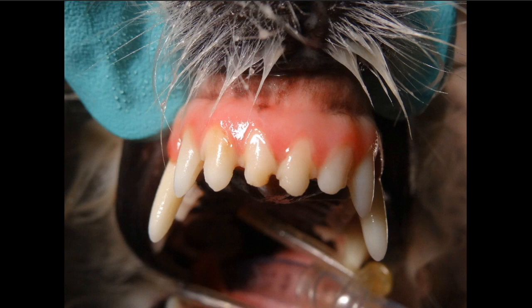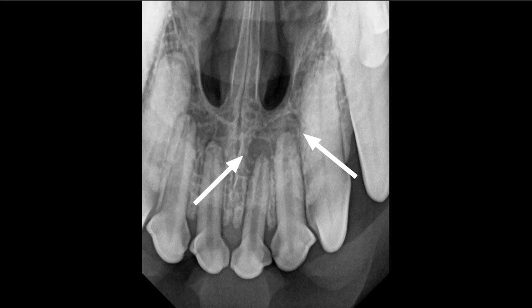And if you look closely there, you're going to see that there's some discoloration. Look at these three teeth versus the color of the other teeth, especially that second left maxillary incisor that's to the right of the arrow there. That one's pretty white. Those are kind of cream colored. So that's a good indication there might be some problems there. And you look at that radiographically, and lo and behold, two of those have a very distinct lucency. All four of those central incisors have increase in the pulp cavity diameter compared to the pulp cavity diameter in those lateral incisors. So those are all dead.